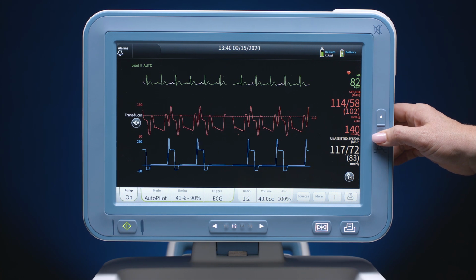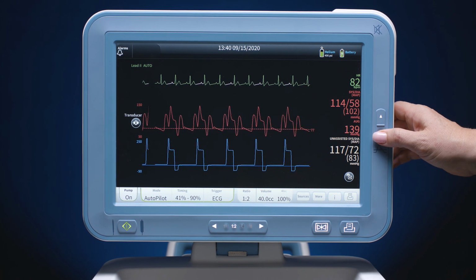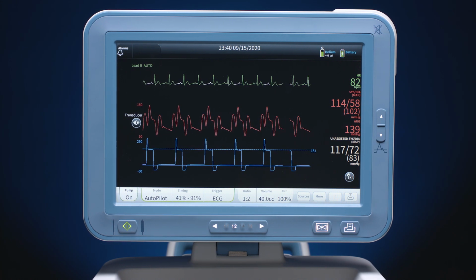Note, wherever the cursor is stopped on the arterial pressure waveform, the user can read the pressure at that point. When the cursor is moved down onto the balloon pressure waveform, it turns blue, and again, the user can assess the pressure at the point it is stopped.